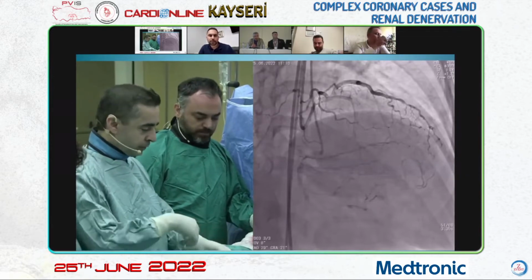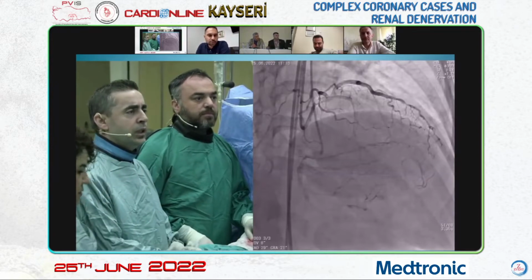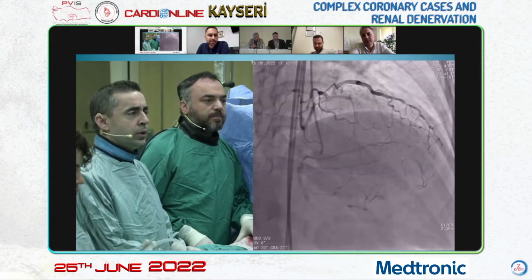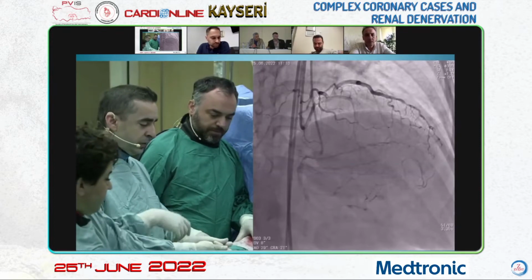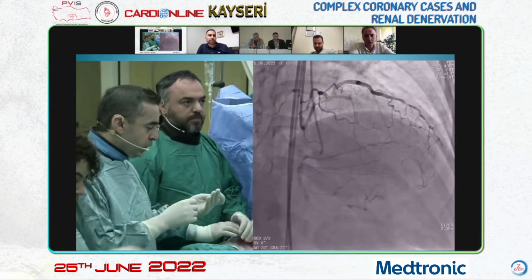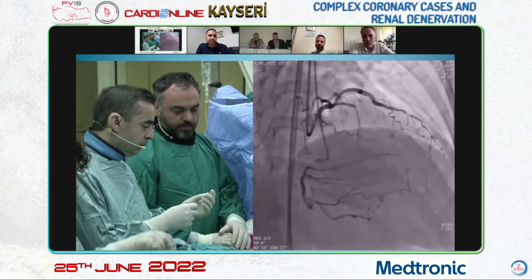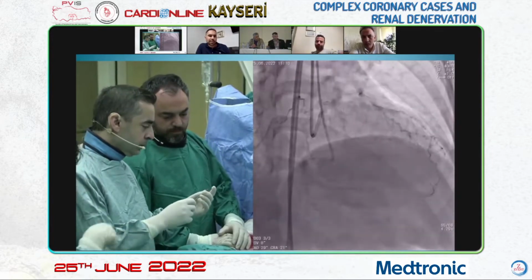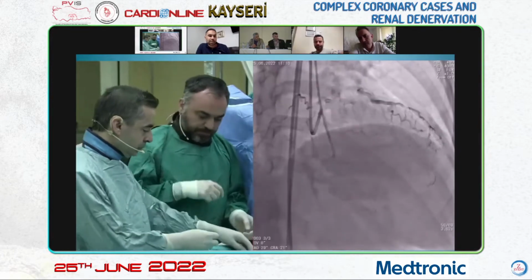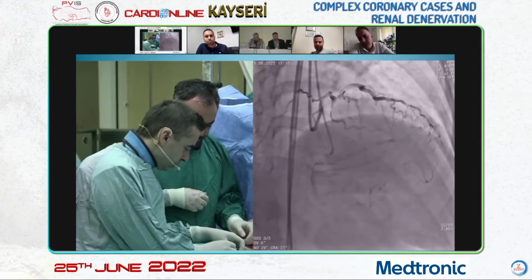Yes, Dr. Korhan, we're listening. Well done. About the previous operation, do you know anything? We only know the failure. The system was not standard. The angiography was not natural. Actually, if we knew how much dissection was done, we would plan better.